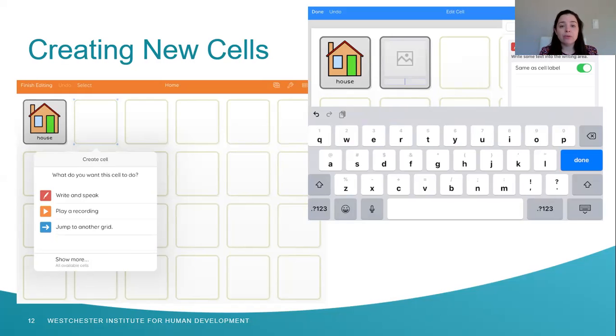system. To have an account, you don't need to have the Grid device. You could start with the free trial, and once the free trial ends, if you're only an editor, you don't get charged the monthly subscription or the one-time charge. You can have an account without having the actual system.